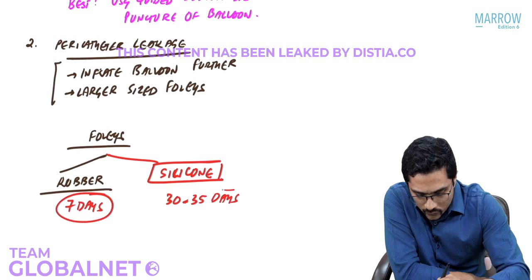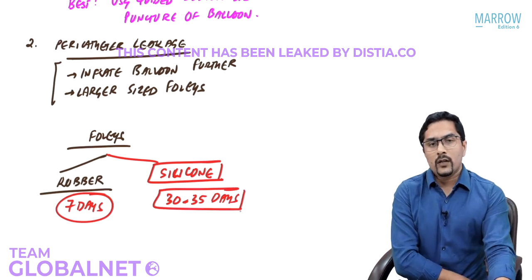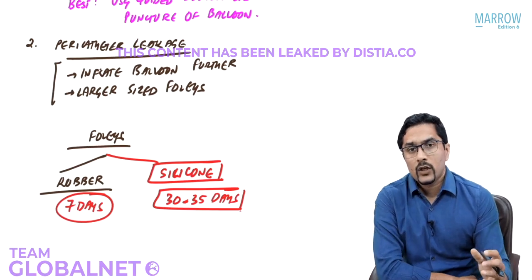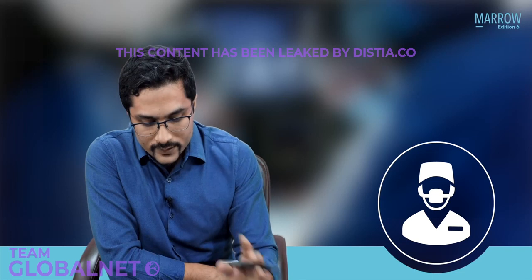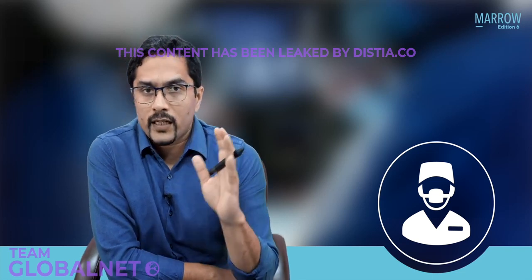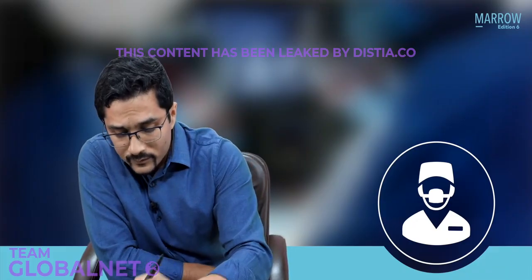And as compared to rubber Foleys, there is less colonization on the silicone Foleys, and UTIs are not that frequent. So these are some points regarding Foley's catheters which you absolutely must remember for your exam.